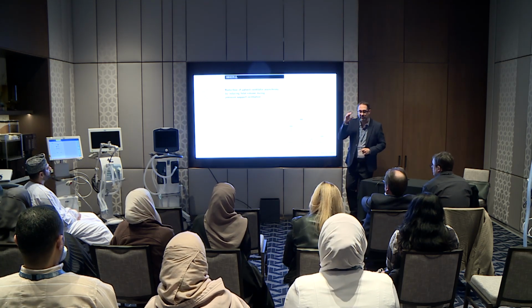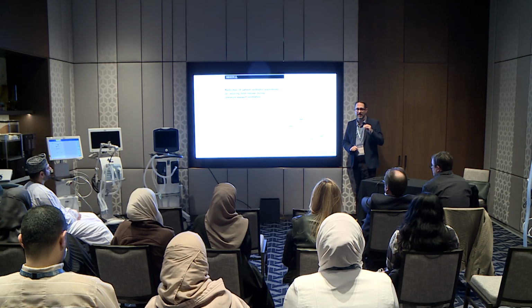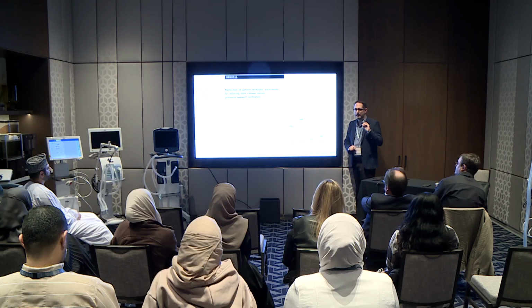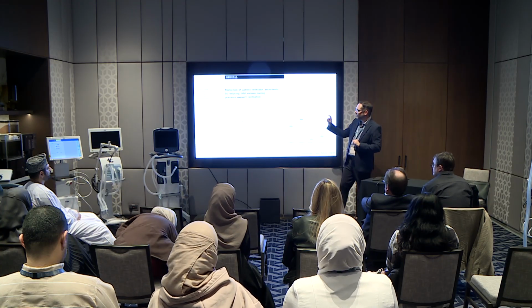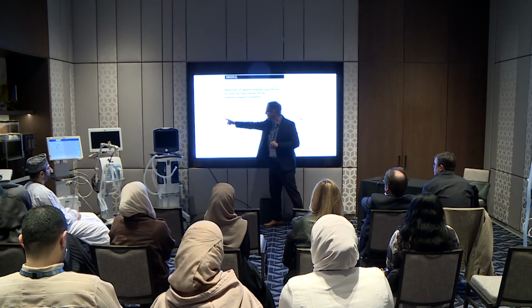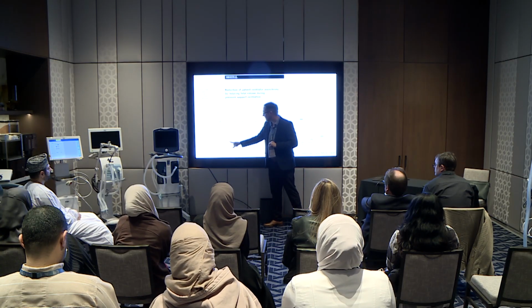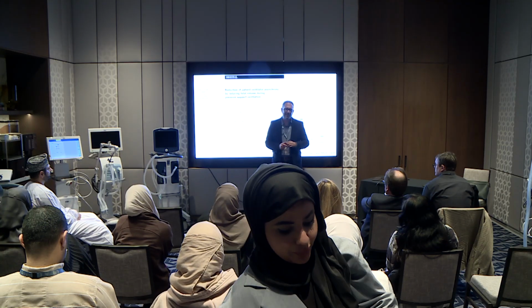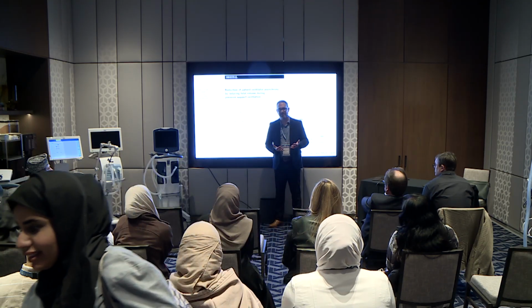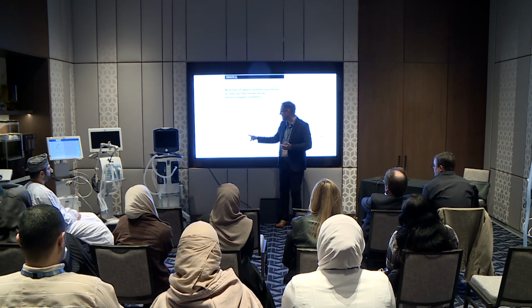So this was a study that was done in terms of how to fix ineffective efforts. I would argue it's one of the easiest things to fix, but it's also the one you need to understand the most when you fix it. So here's evidence of ineffective effort, right? You can see trigger, mistrigger, trigger, trigger, mistrigger. So if you think the problem is the trigger sensitivity, this is why I said it's not the correct response. They can clearly trigger the ventilator, but then all of a sudden they have a mistrigger.